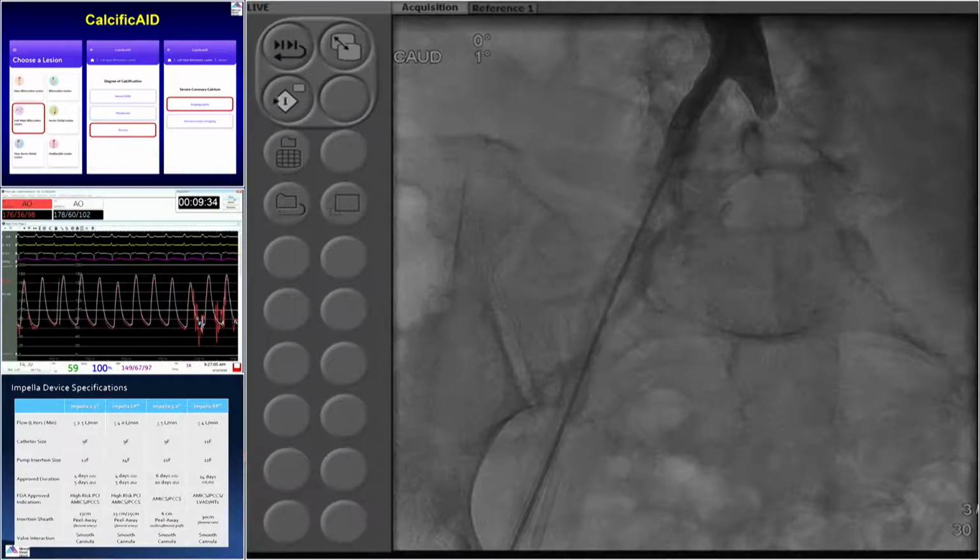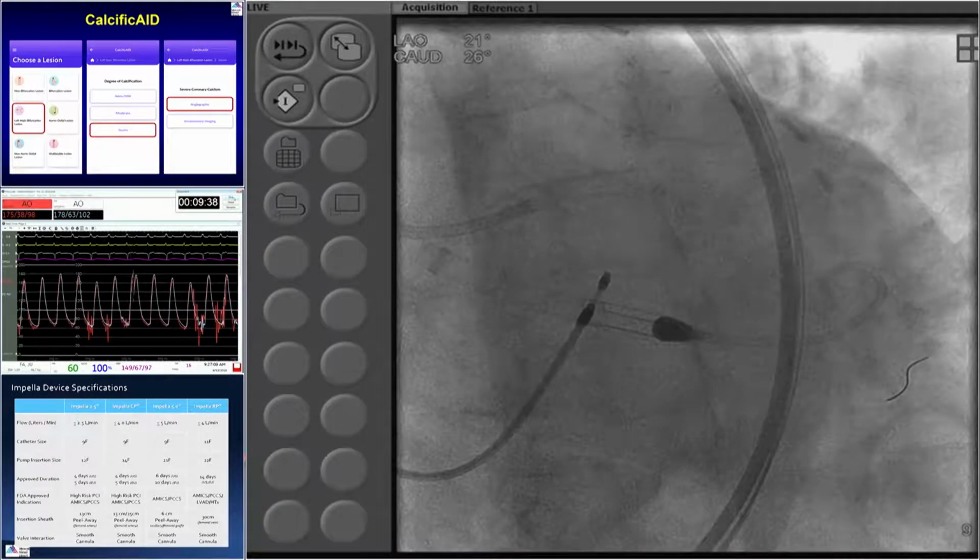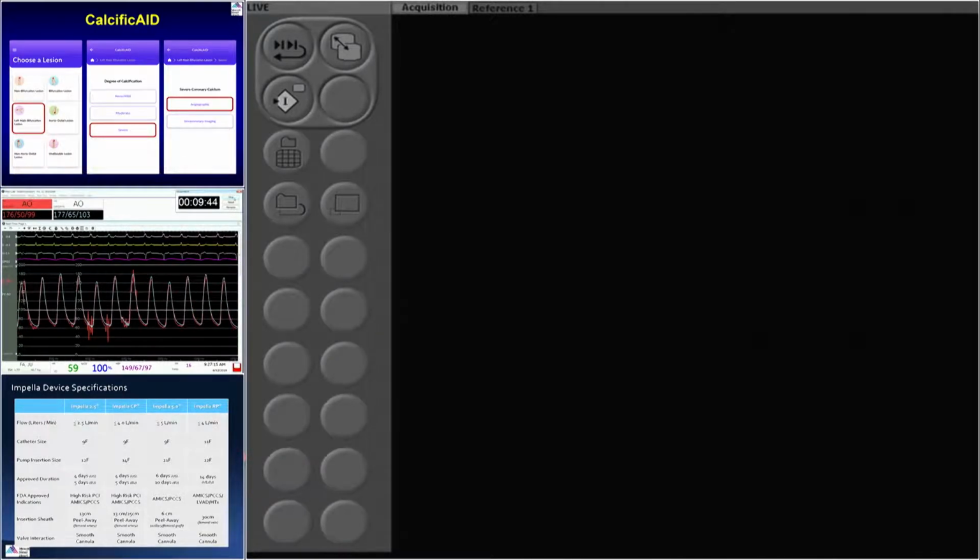One other thing to get yourself more information is to understand what the filling LV pressures are, so that you can be understanding that. And maybe you even do that if you're putting the Impella in, to see as you're going through it what your advantages are. What was the LVEDP when you went in, Pedro? It was 14 to start. Not too bad, yeah.